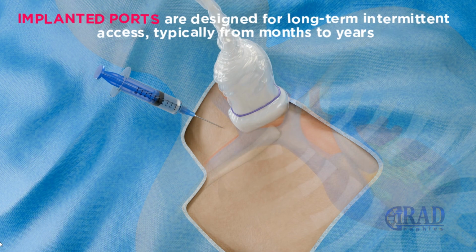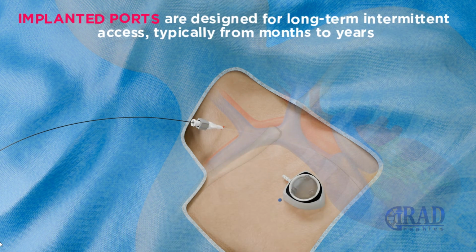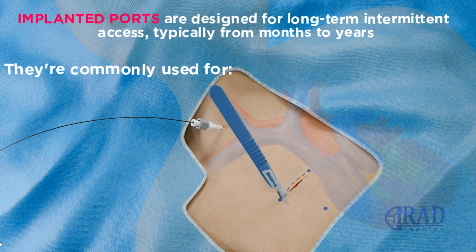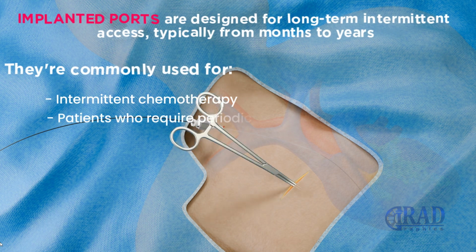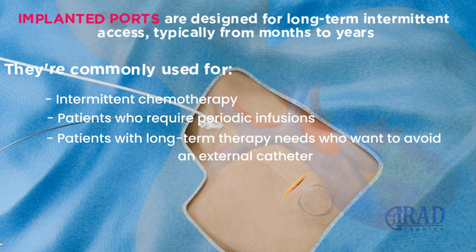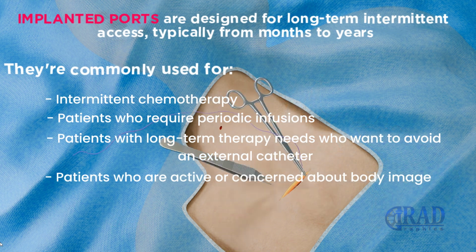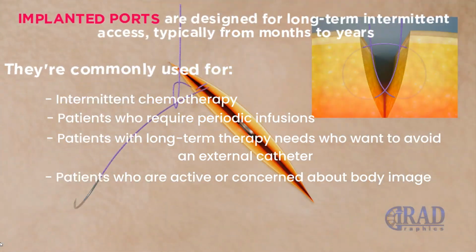Implanted ports are designed for long-term intermittent access, typically from months to years. They're commonly used for intermittent chemotherapy, patients who require periodic infusions, patients with long-term therapy needs who want to avoid an external catheter, and patients who are active or concerned about body image.